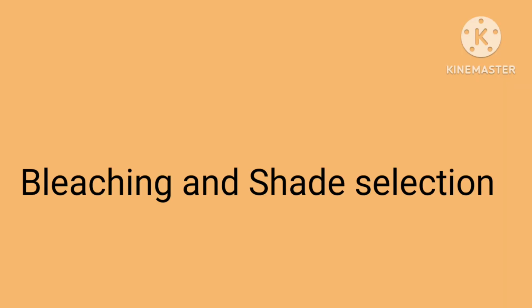Bleached teeth are lighter with altered hues, often requiring special attention during shade selection. Use a bleached shade guide like the Vita bleach shade guide for the lighter options. Match shades under natural daylight to avoid color distortion, and select a shade slightly lighter than the untreated teeth for better uniformity. Wait at least 2 weeks post bleaching for color to stabilize before any restorative work is done.